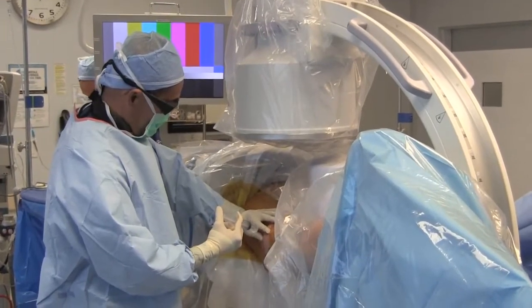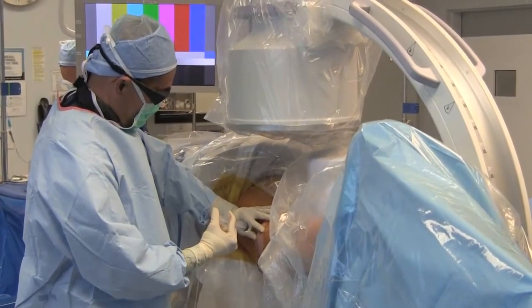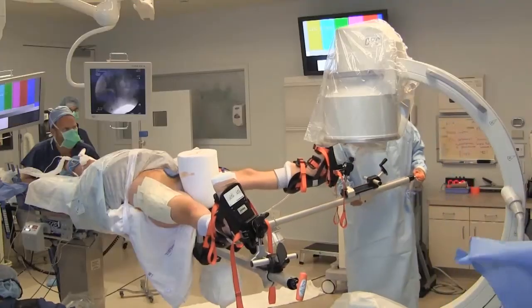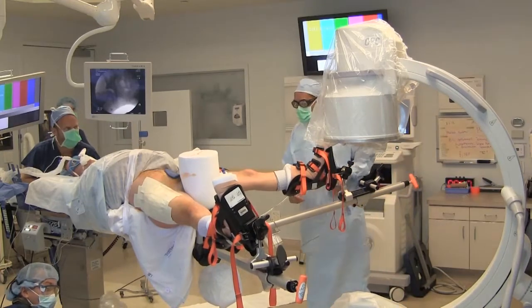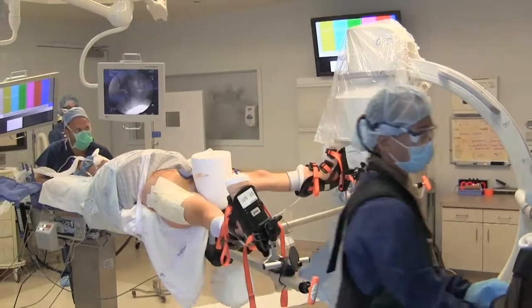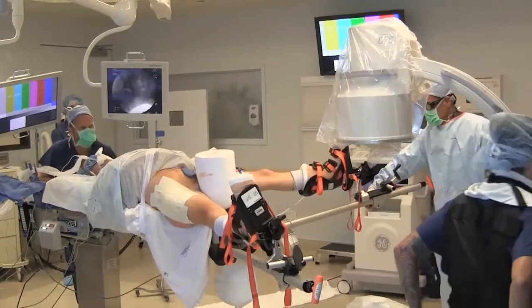Another key step is to inject the operative hip with ropivacaine and 10 milligrams of duromorph. Transition between hips occurs once sterile dressings are applied to the first operative hip. The supine position enables rapid transition between operative hips.